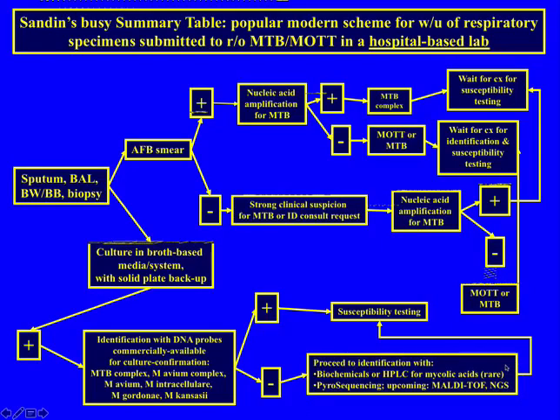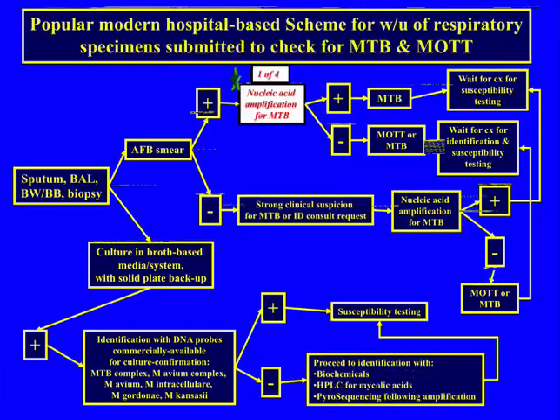Or for the smaller hospital labs, as we'll see in a few minutes, we got MALDI, which started for bacteria, and now there's modifications for yeasts, filamentous molds, and mycobacteria. So it's becoming a tremendously powerful tool for the regular sized laboratory to do identification of even some of these agents.